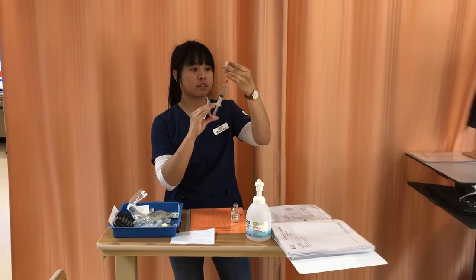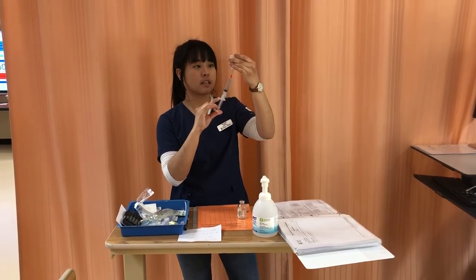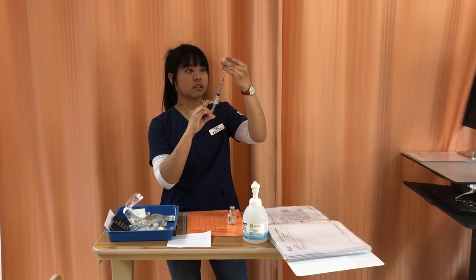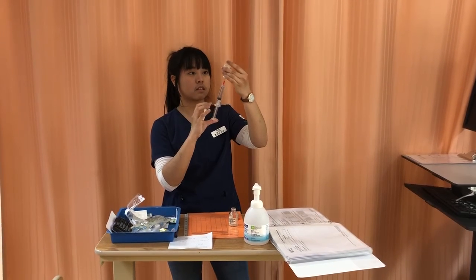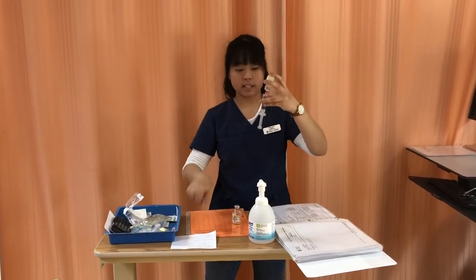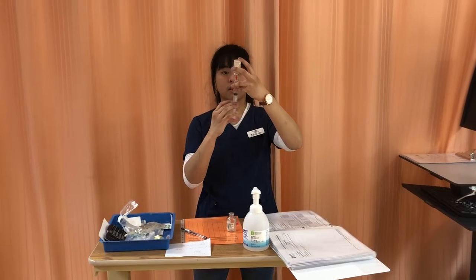I'm just gonna choose this port forward and clean it for 30 seconds and let that dry for 15. Okay, like so. And I'm just gonna take out the excess air bubbles from the tubing.